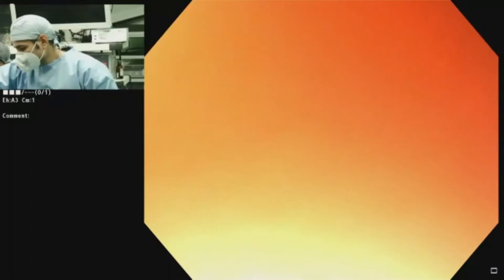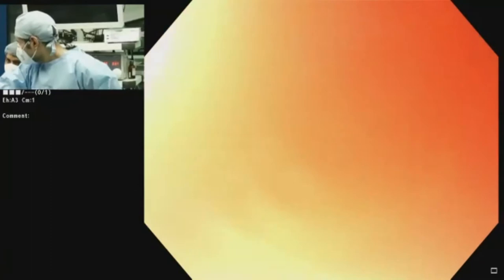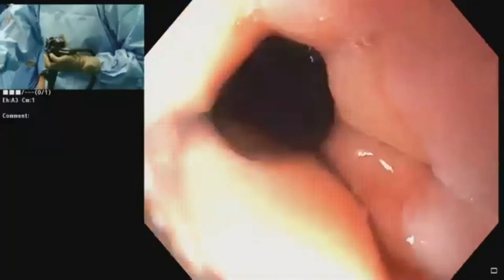Okay. So now I'm going to demonstrate the intraoperative endoscopy here. Dr. Mohak has already explained to you the patient details. So this is quite a huge patient, a very difficult neck. I'm in the esophagus now. Try to go inside and see if we have some findings which preclude performing a procedure. The GE junction is exactly at 40 centimeters.